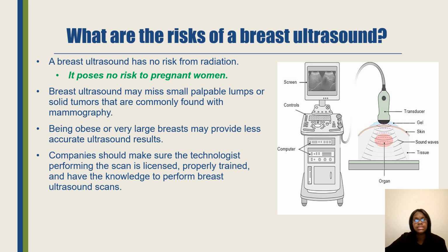The risk that is associated with breast ultrasound is pretty much whenever you have technologists working under or on the machine doing the scans that aren't trained properly or aren't comfortable. So just make sure the tech who is doing the scans are trained properly and they know how to operate the machine, recognize those abnormalities.